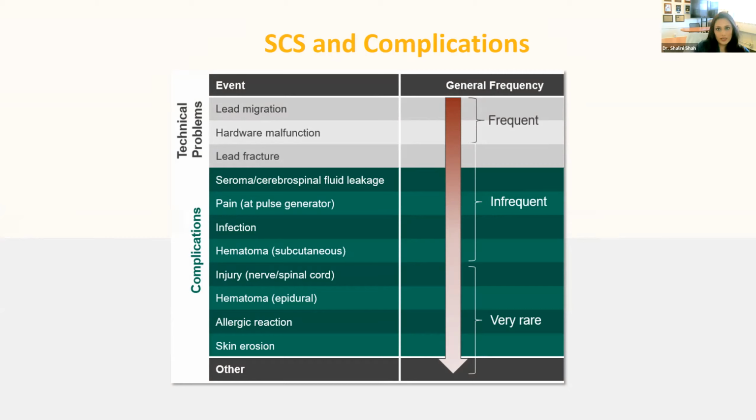But in terms of complications, the most frequent complications that we see with this device is sometimes the lead migrates. Sometimes we'll migrate one segment down or half a segment down. That's typically the most frequent complication.